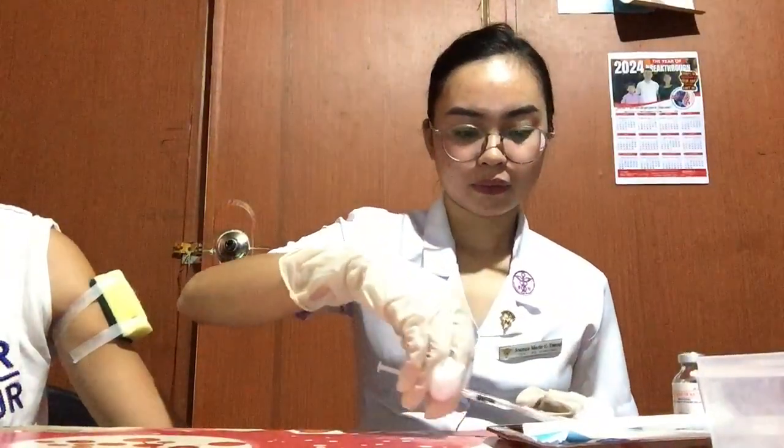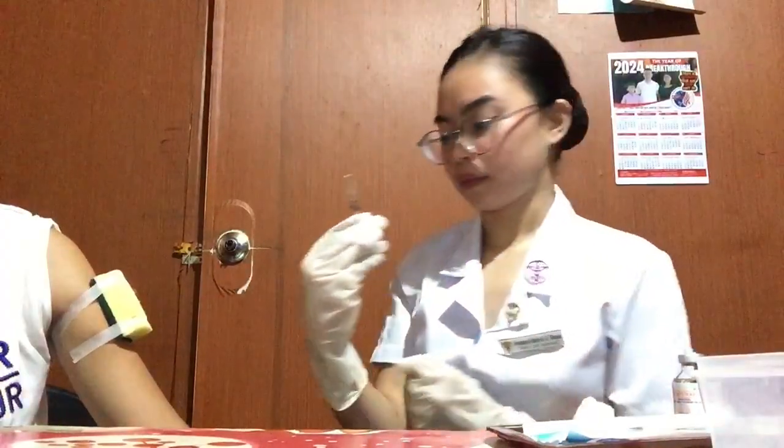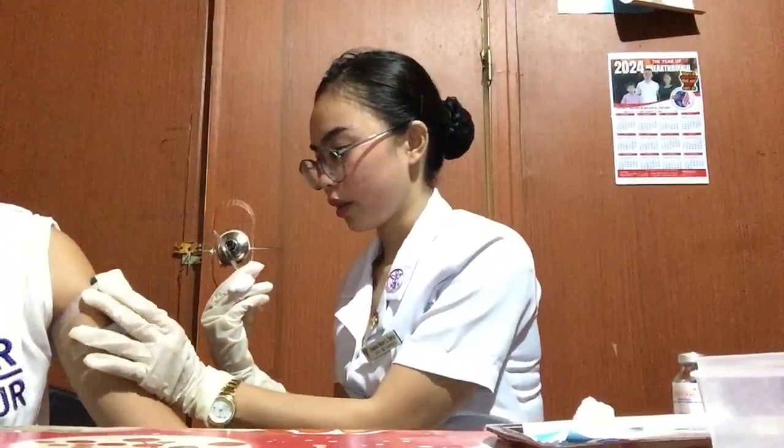And now, using the non-dominant hand, pinch or spread the skin of the site and insert the needle using the dominant hand, with a firm, steady push. When the needle is inserted, move your dominant hand to the end of the plunger.